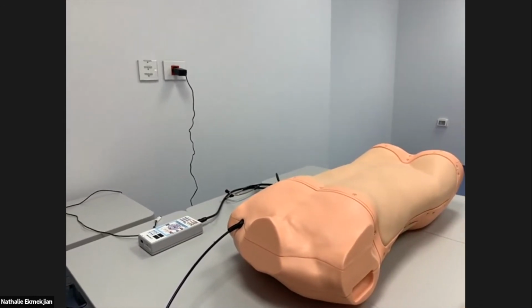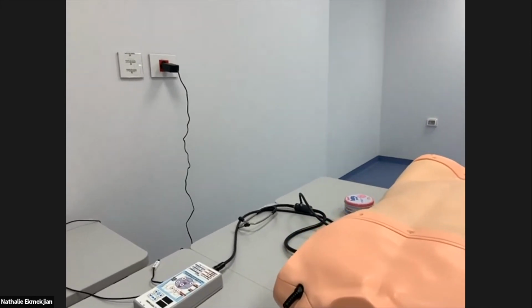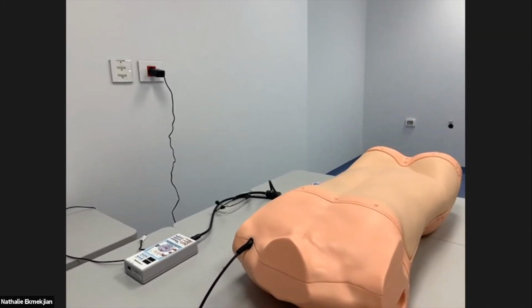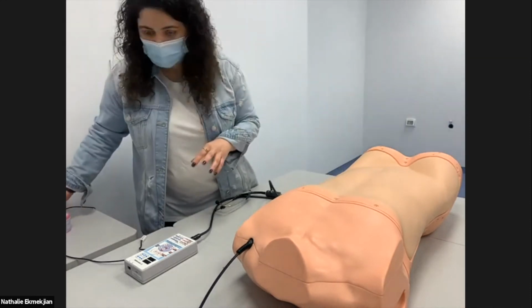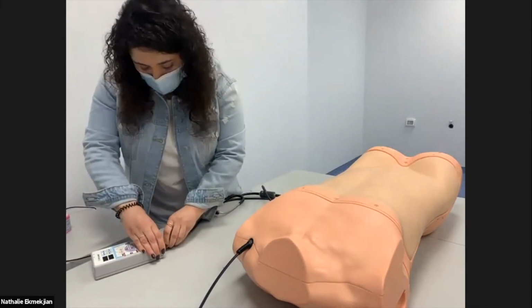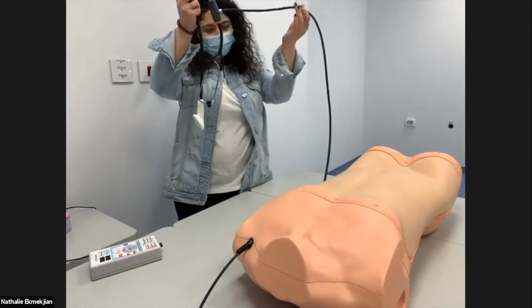I want to show to you the controller, how we work on it. Therefore, as I said, we have, so this is the simulated stethoscope.